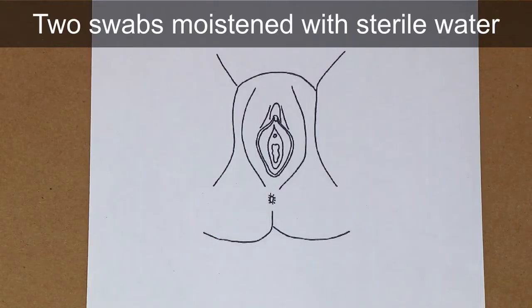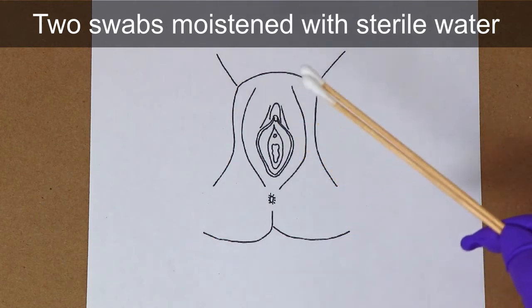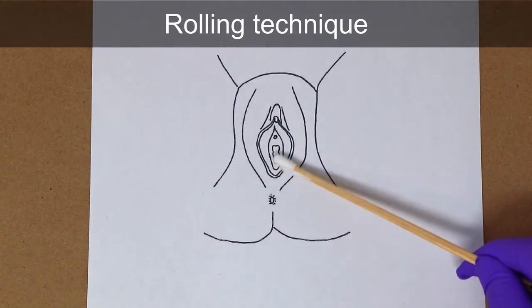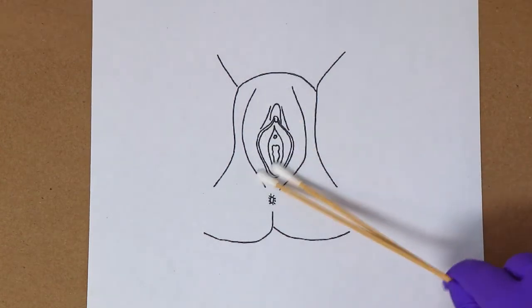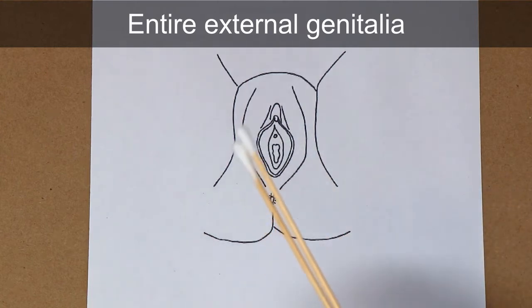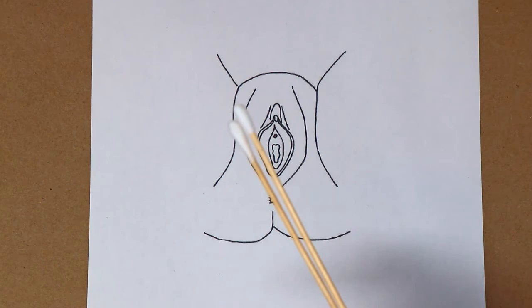If there is digital penetration alleged, samples of the external genitalia may be collected up to 7 days if there's digital penetration of the vagina, and up to 3 days if there is digital penetration of the anus. 2 swabs should be moistened with sterile water. The same rolling technique that is used on other skin samples is used on the external genitalia, and the entire external genitalia area should be included in the sampling. The swabs are placed into sterile swab boxes, labeled and sealed appropriately to be added to the kit.